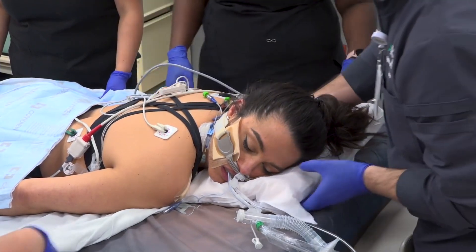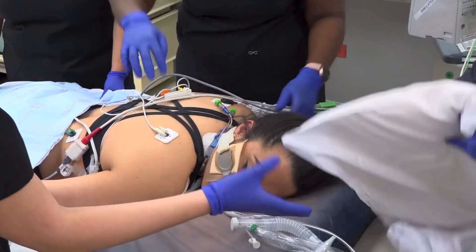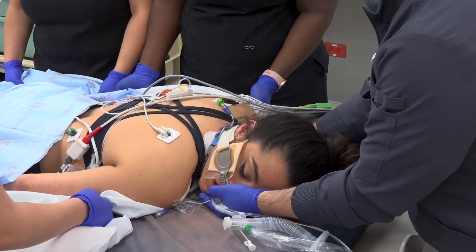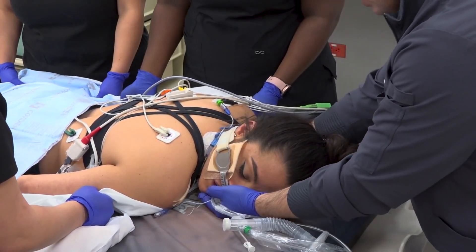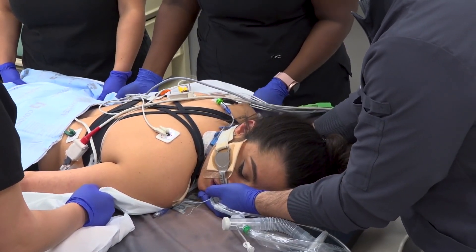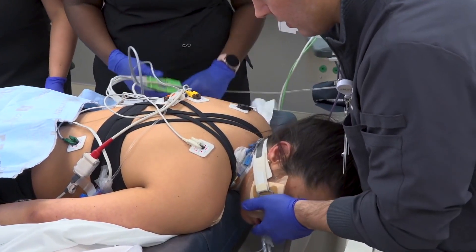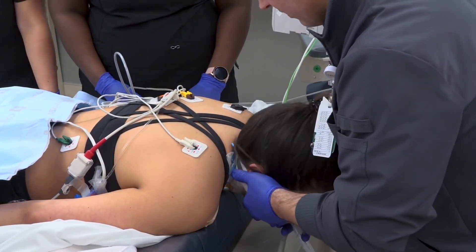This can be done two different ways. The first way is to boost the patient up to the head of the bed so that the head is floating off the mattress, then the RT can tilt the head to the opposite side. The second way is to pull the patient's chest upward while the RT repositions the head to the opposite side. The arms will move along in the swimmer's position as described above.